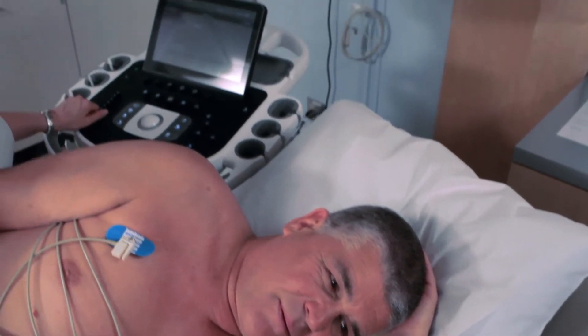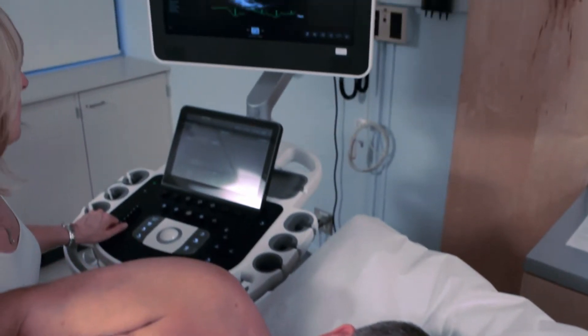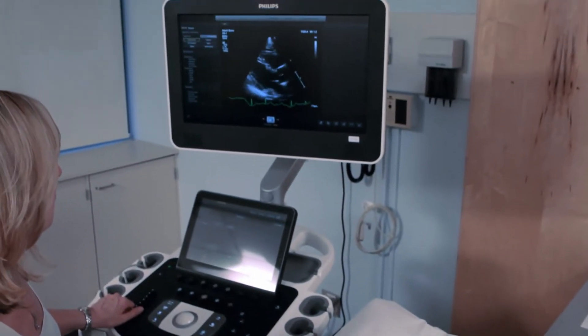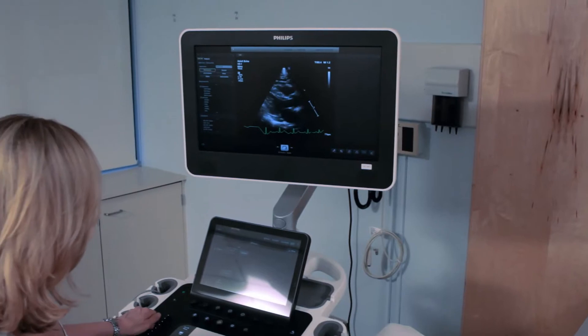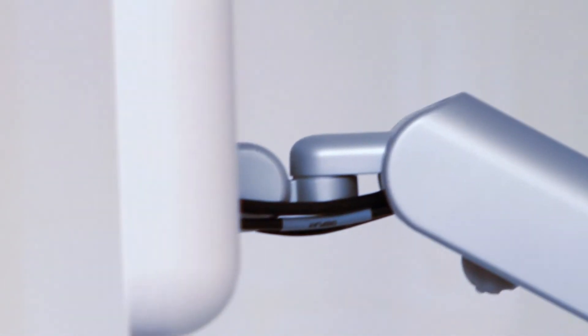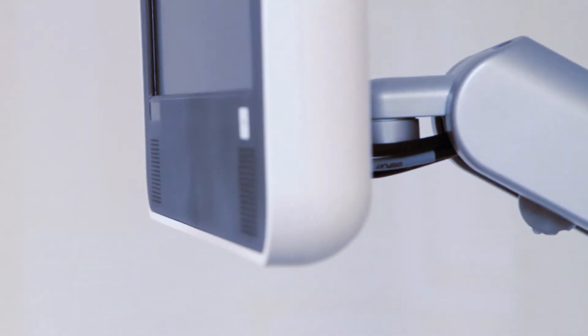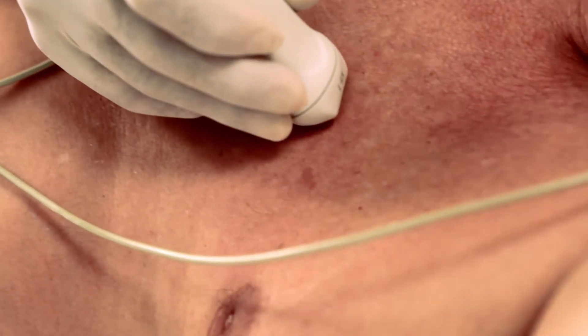Ultrasound helps you do amazing things, and you ask a lot of it. You need superior image quality, even on difficult-to-image patients.